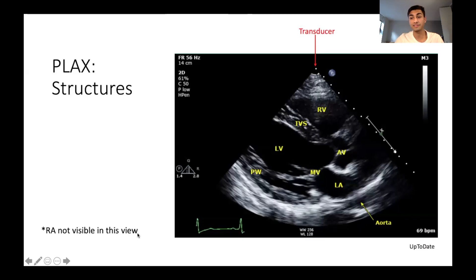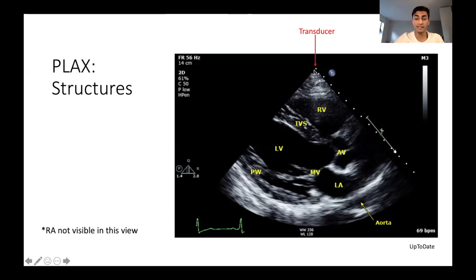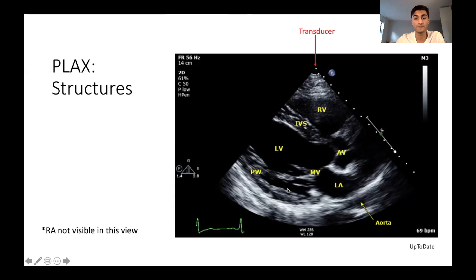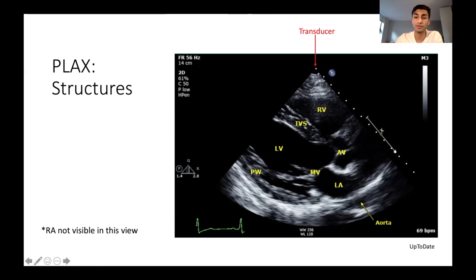Let's start with the parasternal long axis and the different structures we can see. The transducer is located at the top, and the right ventricle is located most anterior because, if you remember the anatomy of the heart, the right side of the heart lies more anterior. So we're able to see the right ventricle, as well as the interventricular septum, left ventricle, left atrium, aortic valve, mitral valve, and the posterior wall. One thing to note with this view is that we're not able to visualize the right atrium, because it lies just outside of this view.